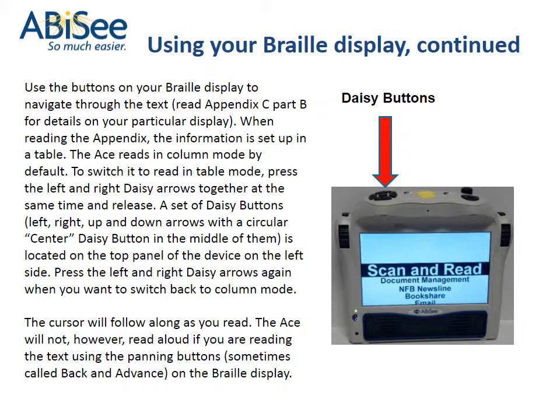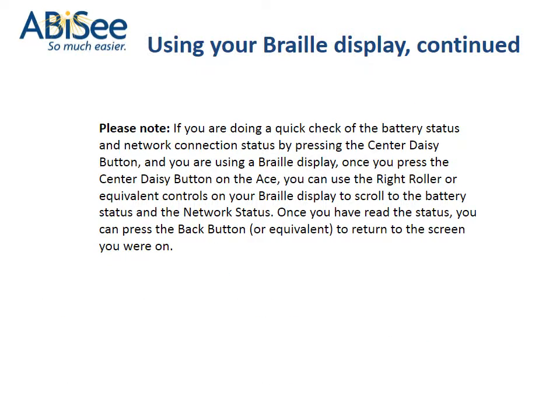The cursor will follow along as you read. The Ace will not, however, read aloud if you are reading the text using the panning buttons, sometimes called back and advance, on the Braille display. Using your Braille display. Continued.